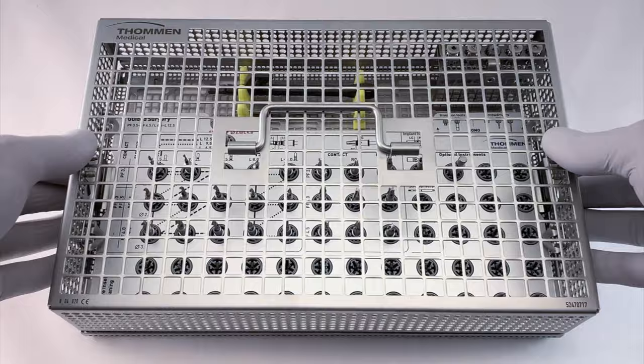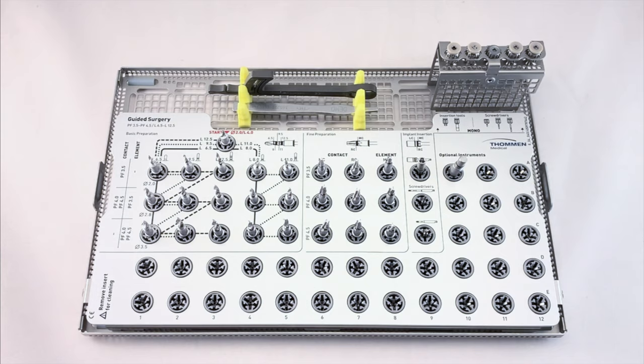Press the latches on the sides of the cassette to open. The layout is clean and simple. Let's begin with a high-level overview and then we can dig into the details of the individual components.